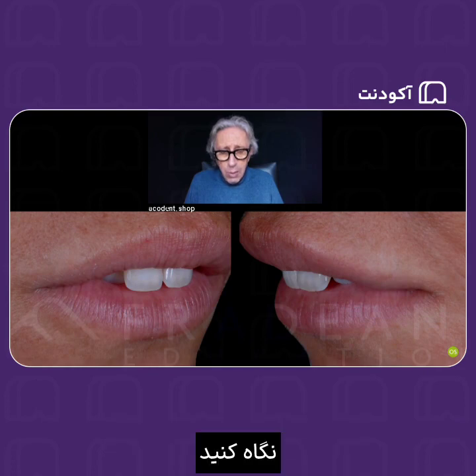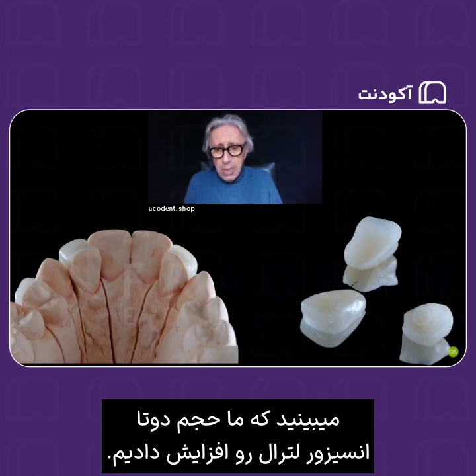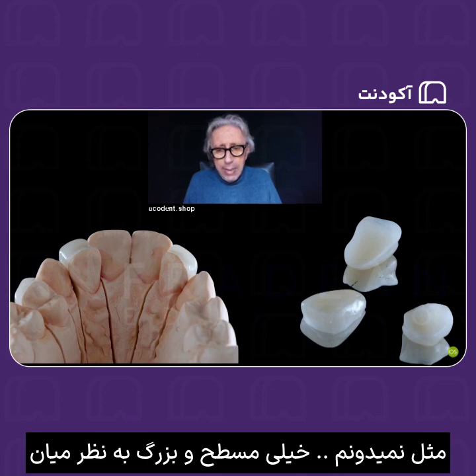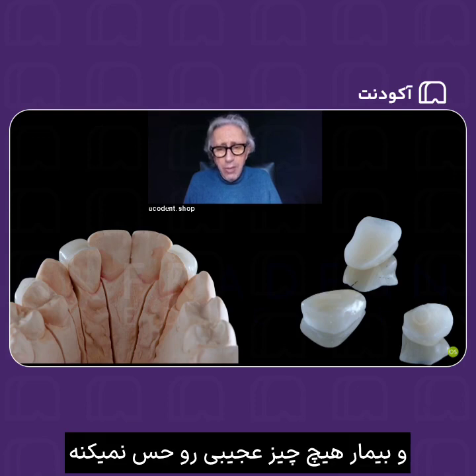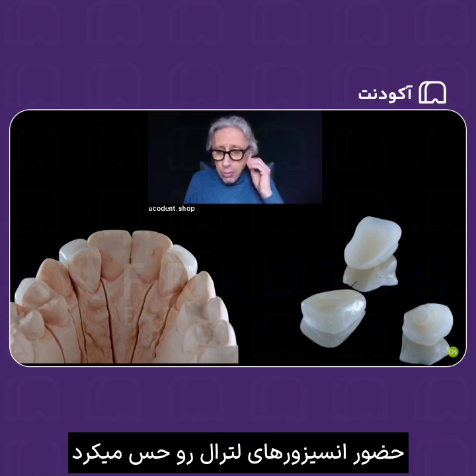this case. Look at this, it seems a rabbit, only the two central incisors visible. You see that we have increased the bulk of the two lateral incisors, and of course, looking at these two veneers on the lateral incisors they seem to be crazy because they are not lateral incisors anymore. They seem to be like, I don't know, a flat area, a big, very large area. But remember, the patient doesn't feel anything strange because on the lingual part, on the palatal part of the two lateral incisors, she had the habit also before to feel the presence of the lateral incisor.